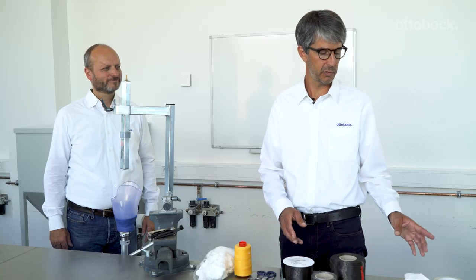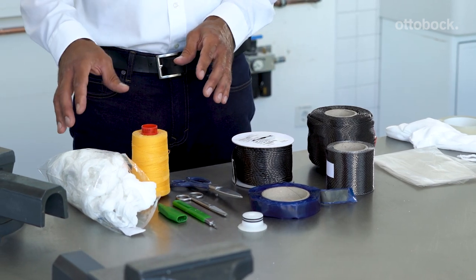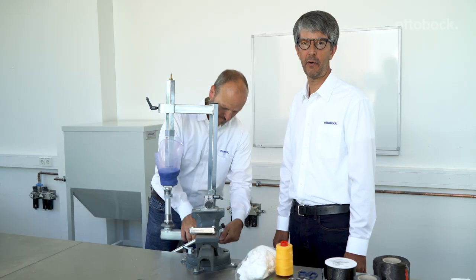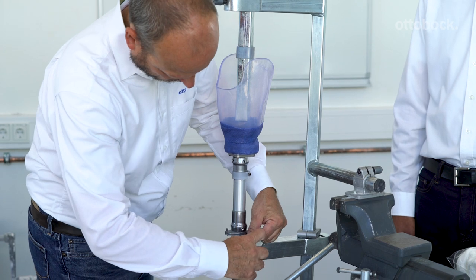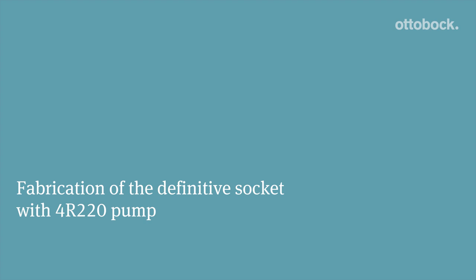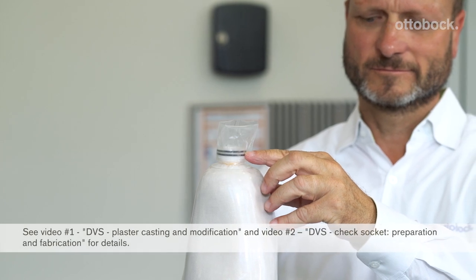The following materials and tools are needed for lamination: standard tape and PVA bag, carbon fibers, and the different layup materials. Please see the IFU for a complete list with part numbers. Using a transfer apparatus, transfer the adjustments made to the check socket to the plaster model — this will guarantee that you have the same alignment with the definitive socket. Modify the plaster model where necessary in preparation for laminating the definitive socket. At this point, we've prepared the plaster model for laminating the DVS socket; the piston dummy has been secured onto the plaster model the same way as when preparing for draping the check socket.